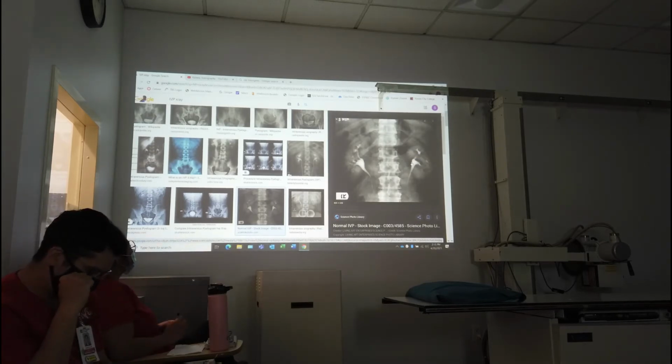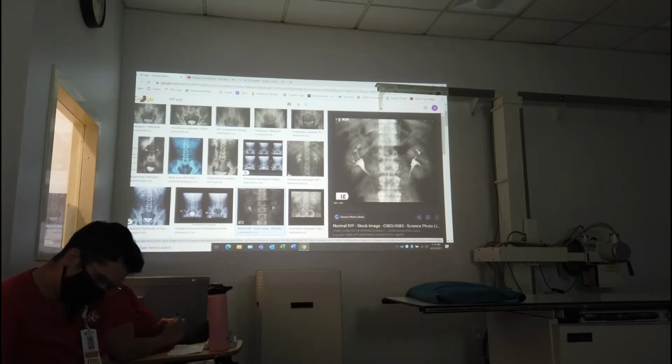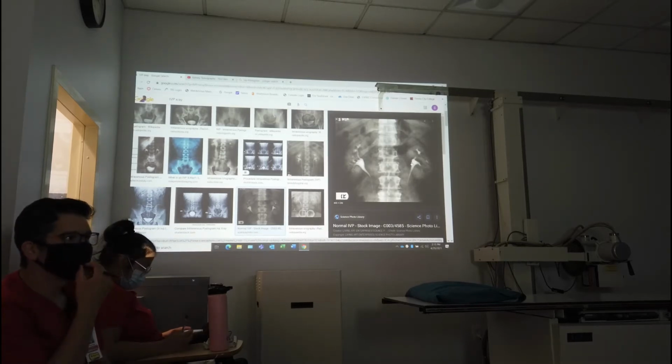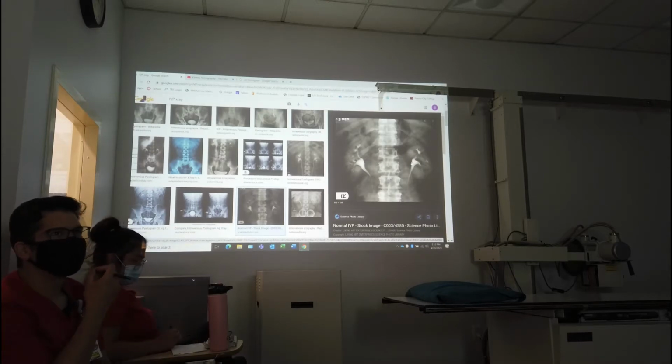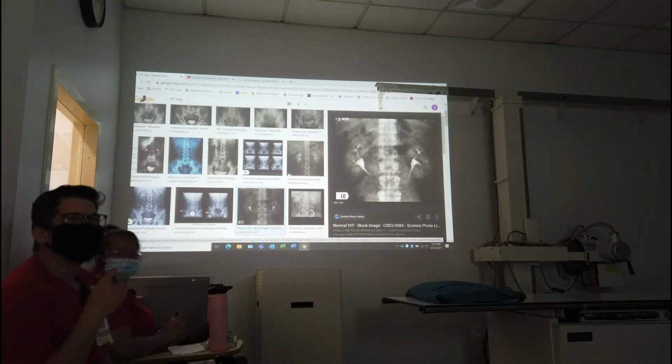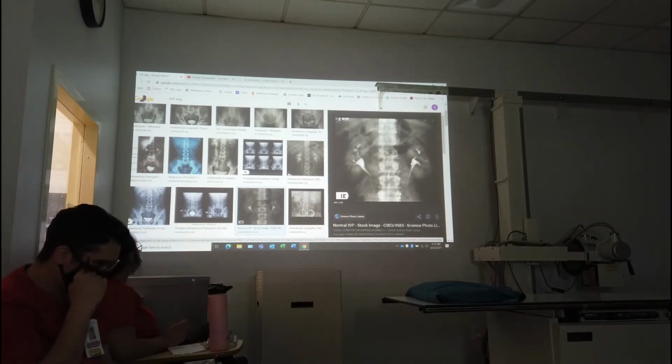So anyway, let's see. Contrast. The reason we can see it is the high atomic number, right? X-rays hit it and get totally absorbed. What's it called when an X-ray is totally absorbed? It's attenuation through what kind of interaction? Photoelectric. We just went over this. Nice, the photoelectric effect. Very good.